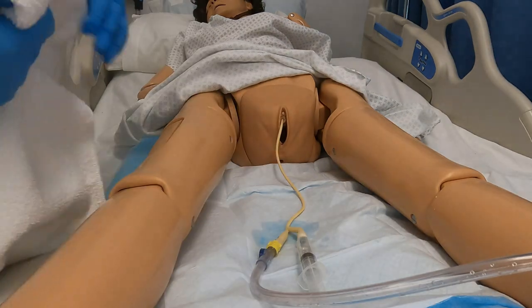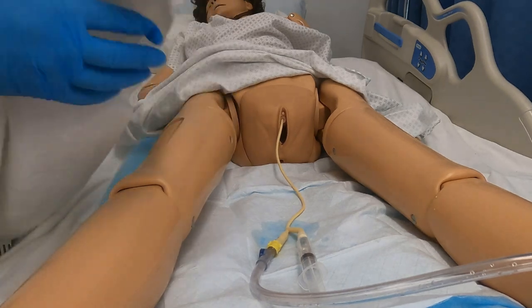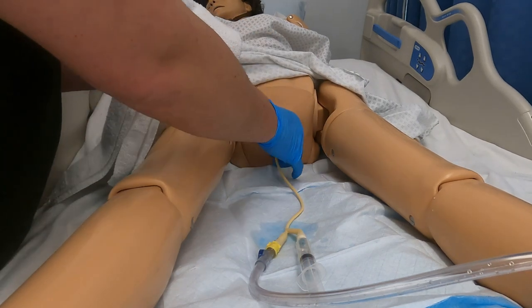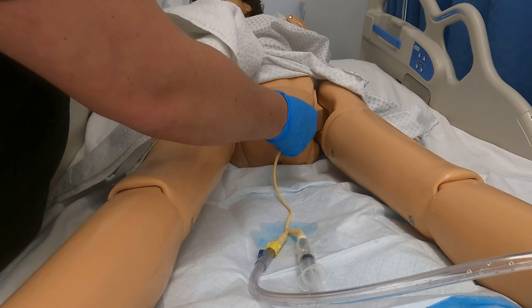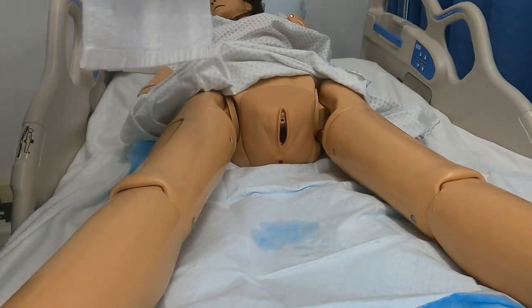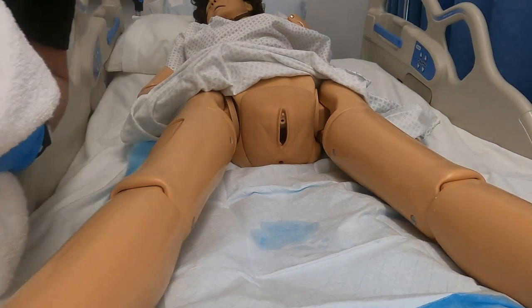I usually have a towel handy. You also want to make sure that you have a chuck or something underneath the patient when you're ready to pull this out. Instruct the patient to go ahead and take some deep breaths. And then when they take that deep breath, I'm going to pull on the count of three — one, two, three — and you want to pull kind of fast and then grab the end. Then you take your whole catheter and toss that in the trash. And that is how you remove your Foley catheter.